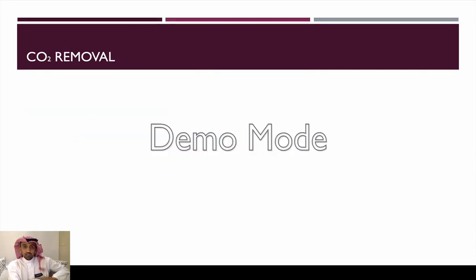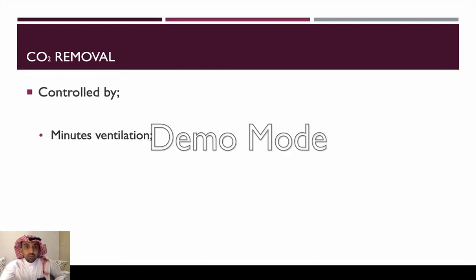So in mechanical ventilation specifically, what controls the carbon dioxide removal, the ventilation? It's controlled by the minute ventilation, which is the tidal volume times the respiratory rate. And this is an important thing to consider, and I will be giving examples later on.